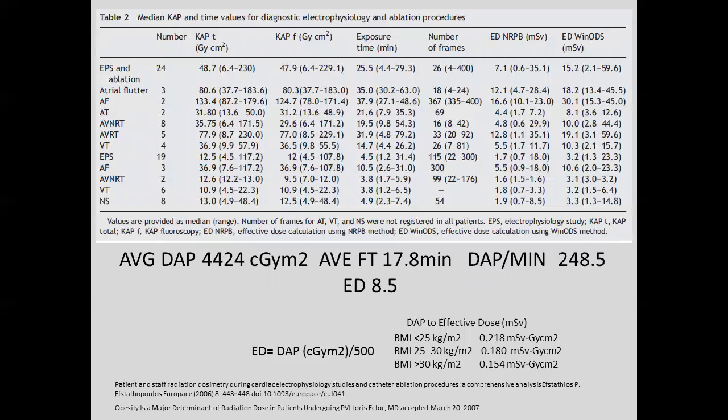So, what is the effective dose from an angiographic or EP procedure? So, this was a study that looked at all kinds. These are all EP procedures.